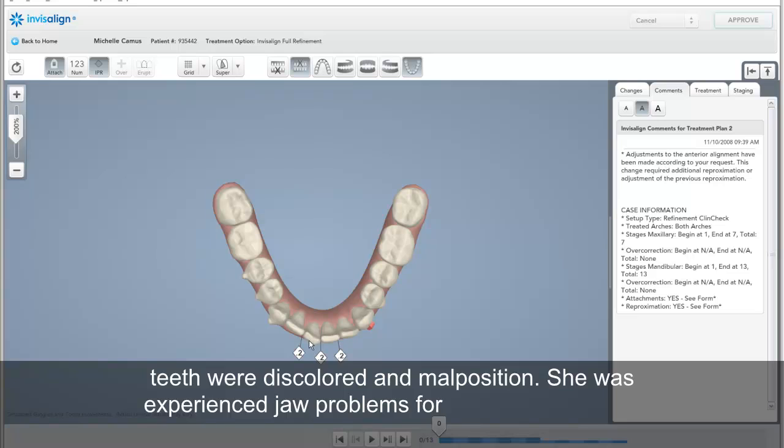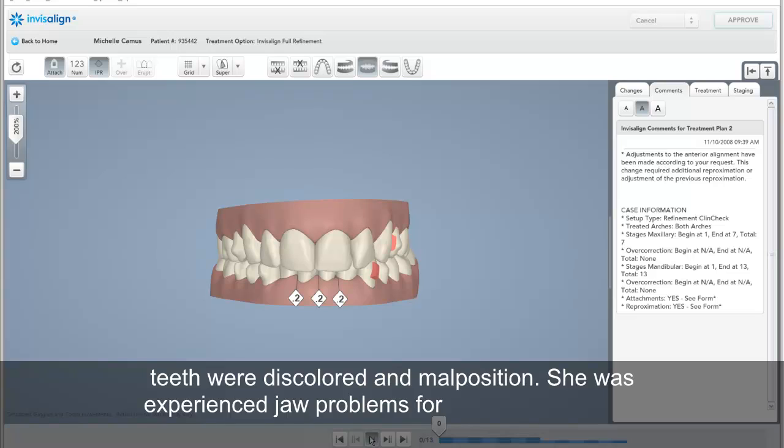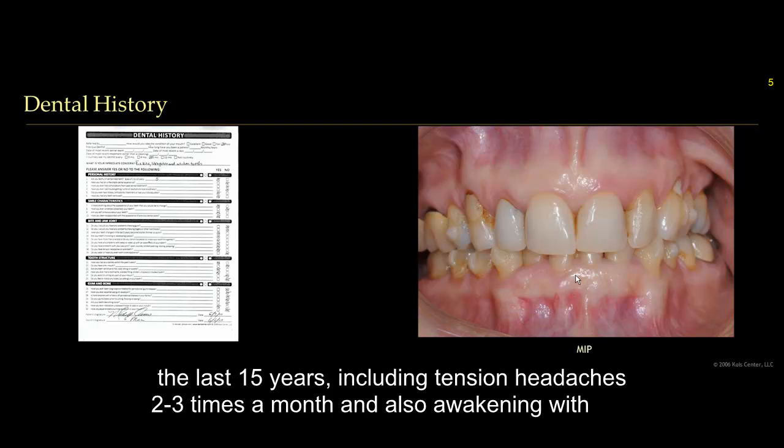You see number 25 more lingually positioned, and number 8 is almost aligned with number 9. So she was wearing the second Invisalign, and the whole treatment took her probably a year and 9 months. The final pictures you can see on the screen right now are, of course, not what you see on Invisalign. If I would approach this case right now, I would probably go a little bit differently. But what the patient also wanted at the end of the Invisalign treatment is full rehabilitation, top and bottom. Okay, and I'll show you why she made this decision.